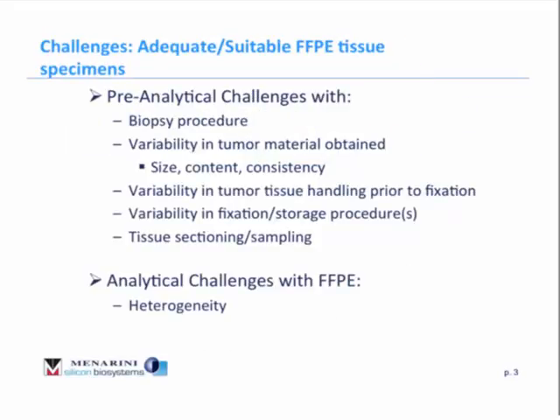However, there are appreciable limitations that can impact the utility of FFPE specimens in the clinical setting. These limitations fall into basically two categories. The first being pre-analytical challenges associated with samples based on where the biopsy is obtained from, how the biopsy is performed, and as well as how the sample is processed, fixed, and stored for subsequent use. Secondly, there are analytical challenges. These challenges really fall into specific categories, most of which involve heterogeneity at the intracellular or intragenomic levels.